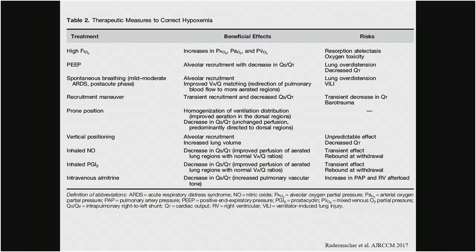of alveolar collapse, okay? And this can be done in different ways, which I think will be addressed in the future talks in the next few days. But just briefly, one is to increase PEEP, the positive end-expiratory pressure, which maintains the lung in a more recruited state. We'll have a few slides later about this as well.